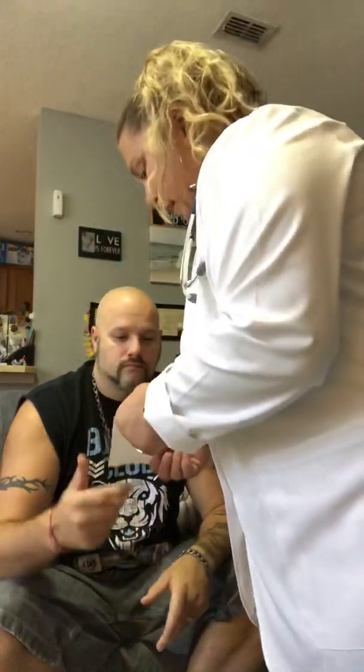We can check the visual acuity, which we will do using my little eye chart. I'm going to have you hold that there with both eyes. Read to me the smallest line that you can. 4, 2, 5, 7, 3, 9.